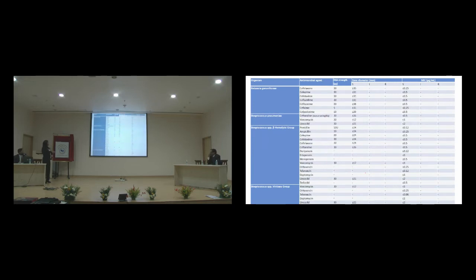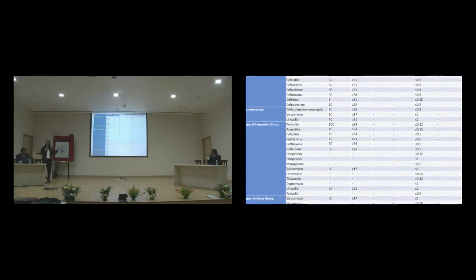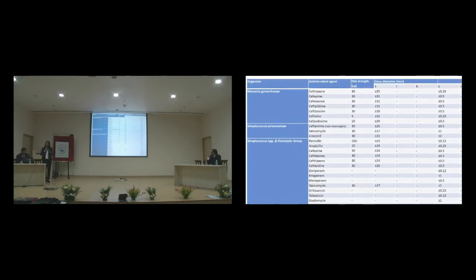So again, these are the categories. Beta hemolytic streptococci, there are many drugs where there is only sensitive breakpoint defined. For such drugs, you have to report it as non-susceptible. Okay? There is a long list. She has compiled everything into a table.